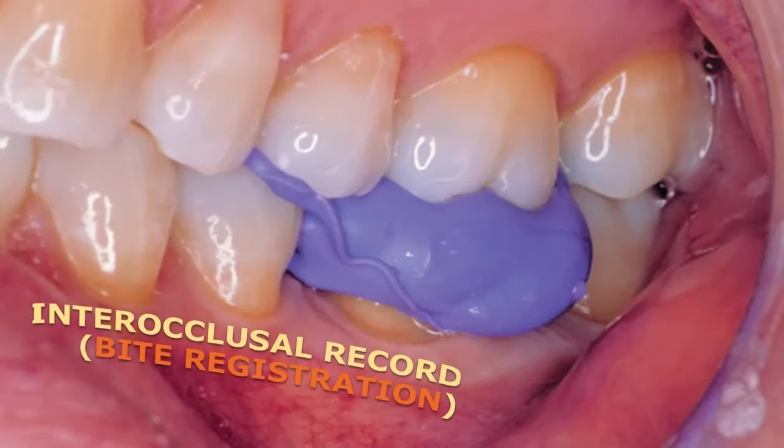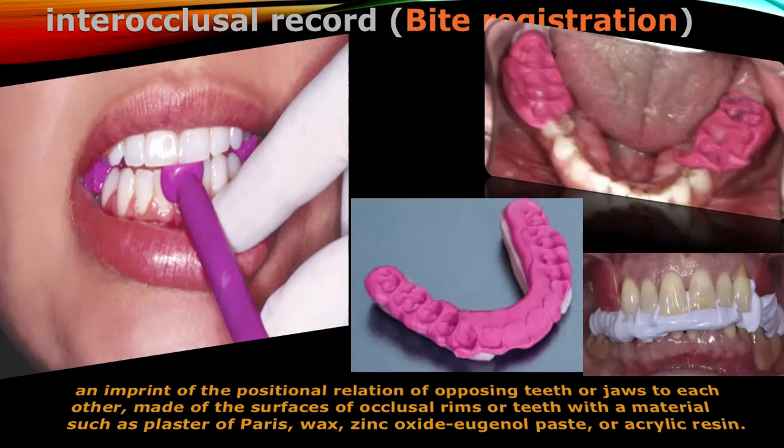آخر محاضرة تكلمنا بيها على الامبريشن. هذه المحاضرة next step after impression هي interocclusal record or the bite registration. طبعا البايت registration أو interocclusal record هي عملية نقل position relation of the opposing teeth or jaw to each other، عملية تسجيل هذه العلاقة ومن ثم نقلها إلى الارتكليتر.